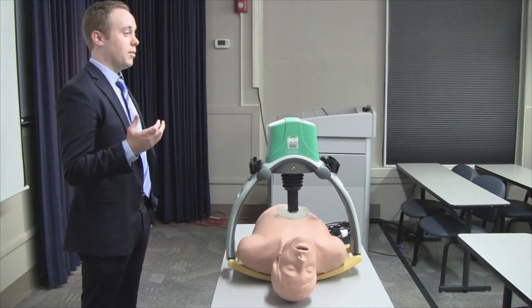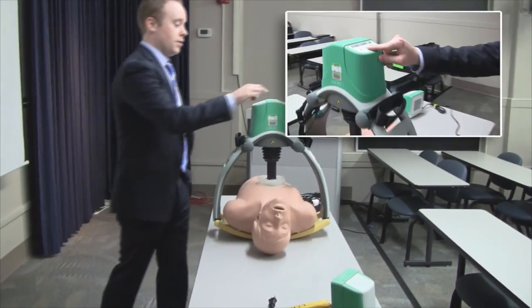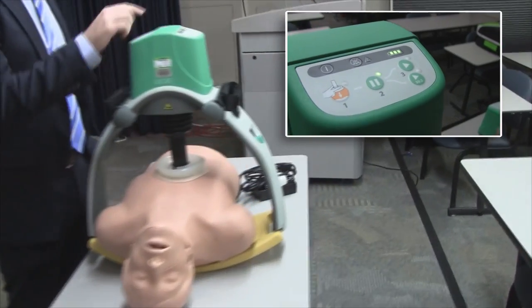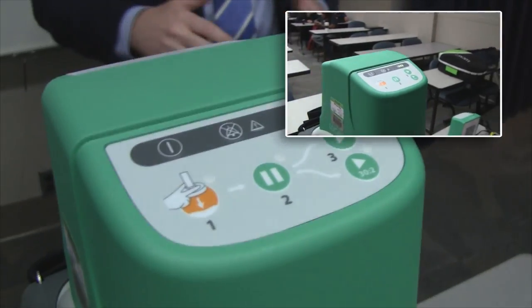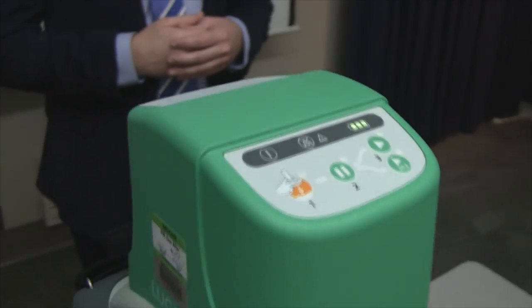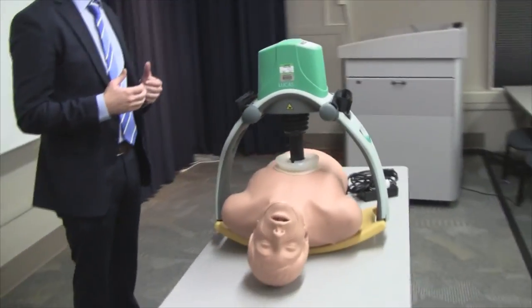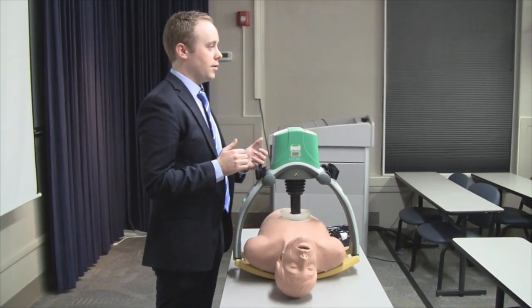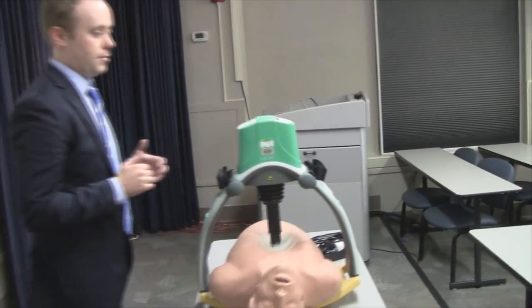In continuous mode it'll just continue to do compressions until you need to pause for any reason — to check the underlying rhythm or to defibrillate. There's a pause button right in the center; hit that, and when you're ready to start compressions again, hit the play button. Very minimal interruptions, even less so than having fully rested staff switching off every two minutes. You can really maintain that perfusion level. For a non-intubated patient needing a 30-to-2 ratio, that's available as well.